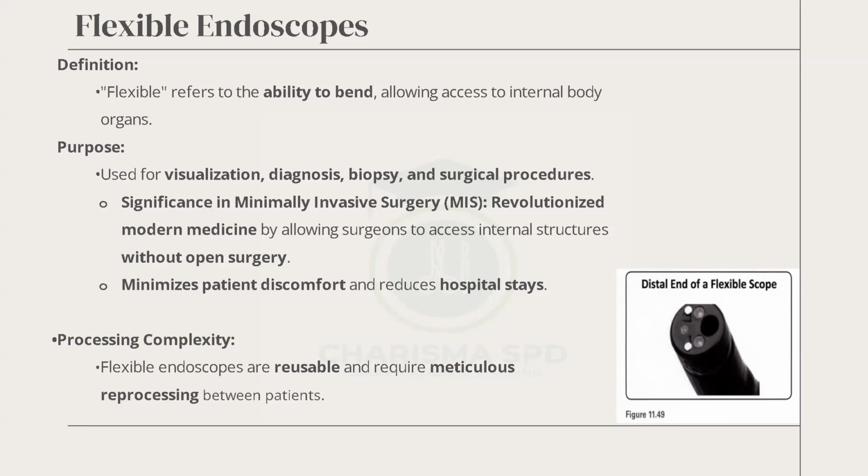The colonoscope goes through your behind. So remember that. You can imagine both will come dirty, especially the one from behind. So when you are treating it, gown yourself well and don't cut corners. Next slide.